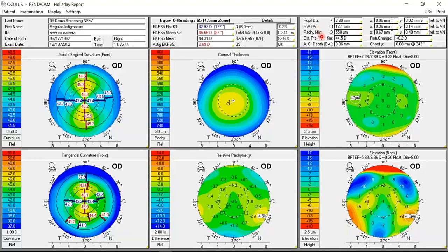In the upper right window are parameters related to the map: pupil diameter, white-to-white, pachymetry minimum, the estimated preoperative corneal power before refractive surgery, ACD depth, and chord mu. The six maps below are organized in three columns — the first column has topography maps (axial and tangential), the second has corneal thickness and relative pachymetry, and the third has elevations above a toric ellipsoid reference surface for both the front and back surface.